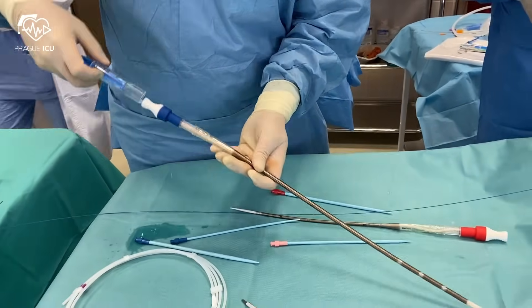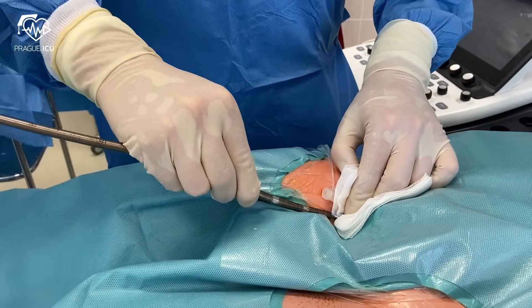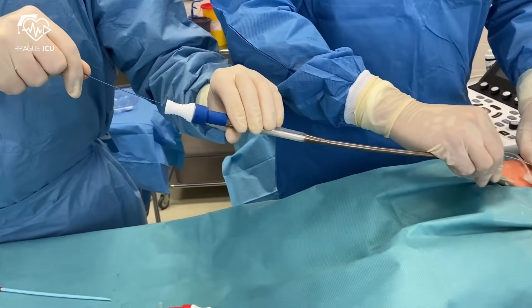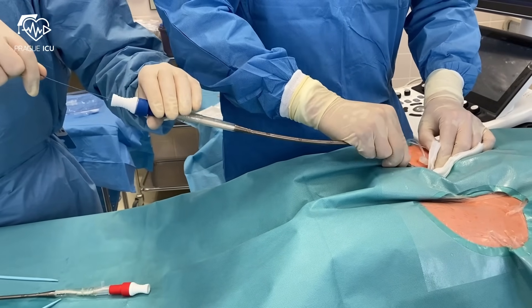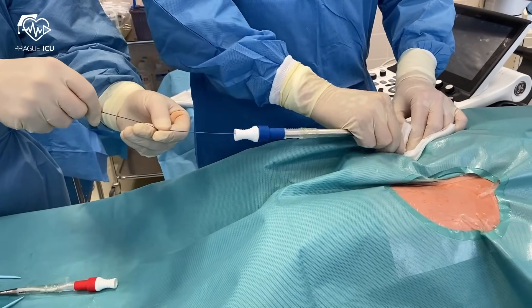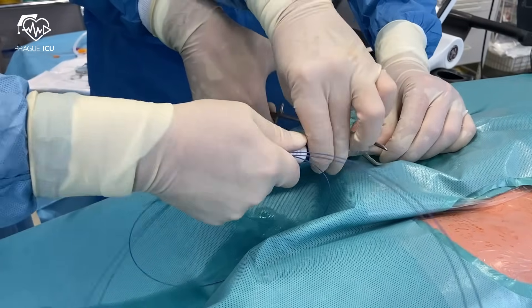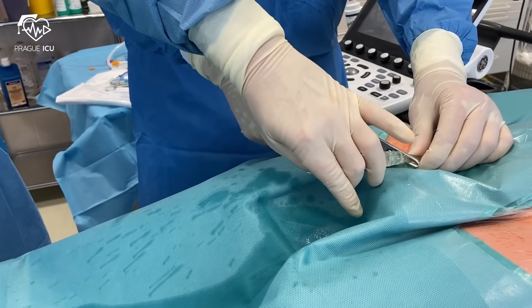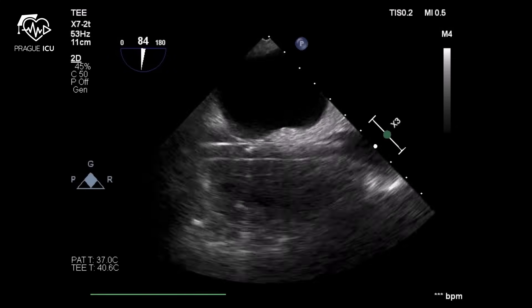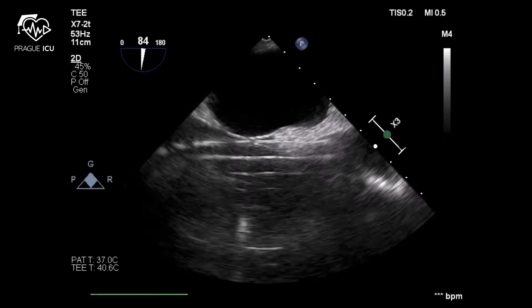After the final dilation, flush the ECMO venous cannula and insert it. Then remove the wire with the introducer and clamp the cannula. Insert the cannula to the desired position in the right atrium and confirm it with TOE. The mid-esophageal bicaval view of the right atrium should show the cannula extending from the inferior vena cava to the junction of the right atrium and superior vena cava.